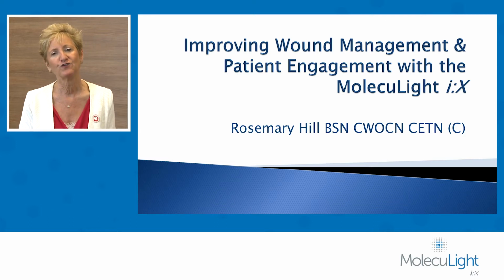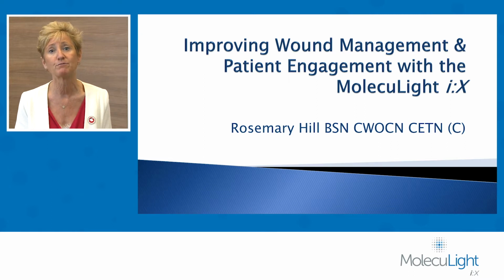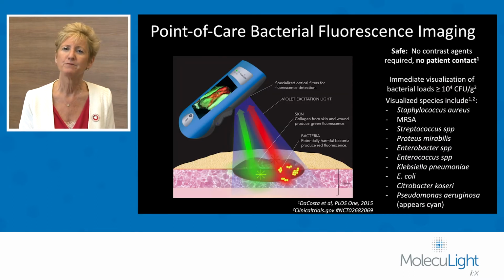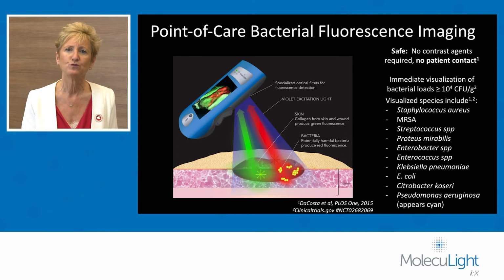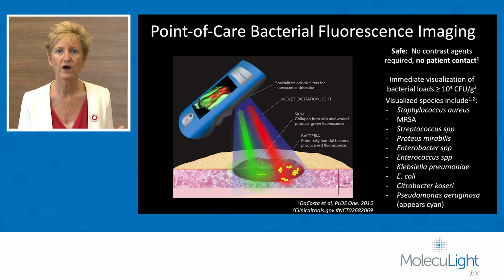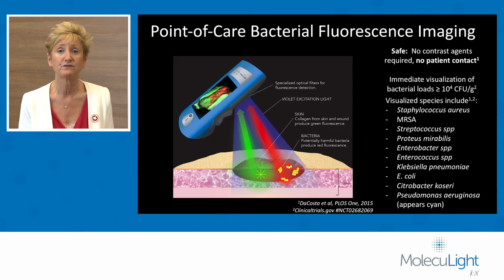Today, I'd like to talk to you about improving wound care management and patient engagement with the use of MolecuLight. I'm not sure how many of you are familiar with this particular tool, but you will shine a fluorescent light at the wound bed, and it is going to give you a real right there in point of time picture of what's going on at the wound bed in terms of where the bacteria is located, and you're going to get an impression as to what's happening at the wound surface.